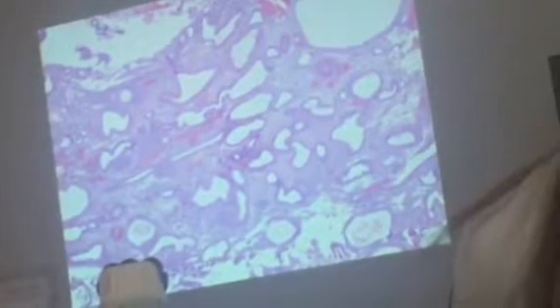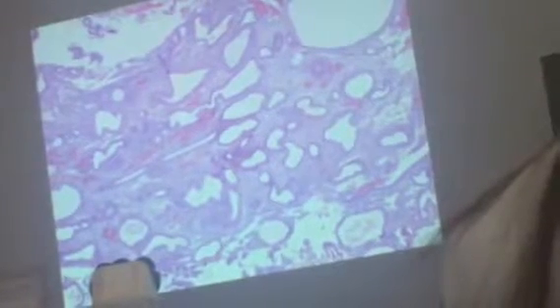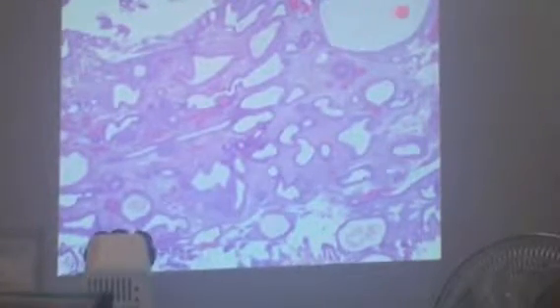Mas abundant, in other words, yung stroma compared to the glands. But if you begin to see an equal to more than 1:1, then that's already hyperplasia. Okay. It's easily recognizable. Simple endometrial hyperplasia is easily recognizable because of the cystically dilated glands.